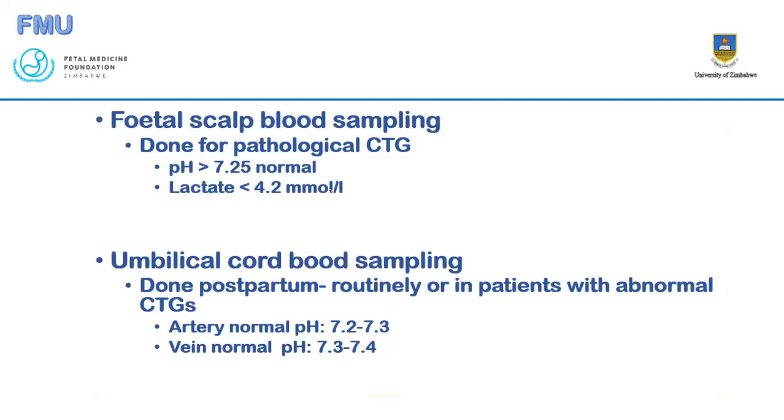Tachysystole means many contractions. I'm not going to talk about this. Probably we will evolve to this level at some point, but I will skip this slide. I don't think it's relevant.